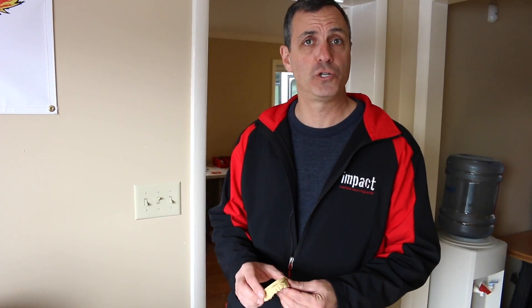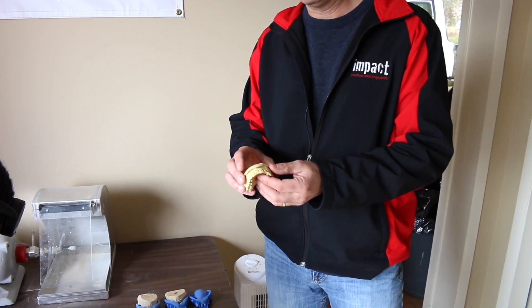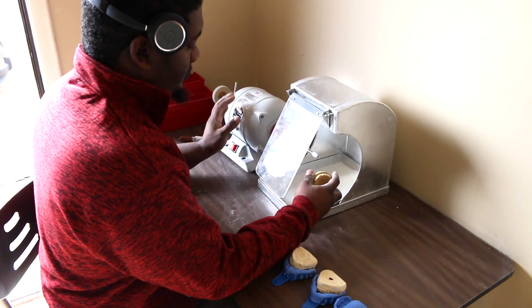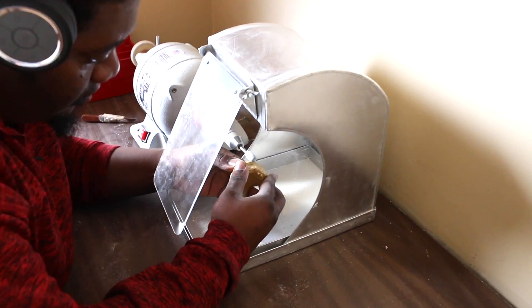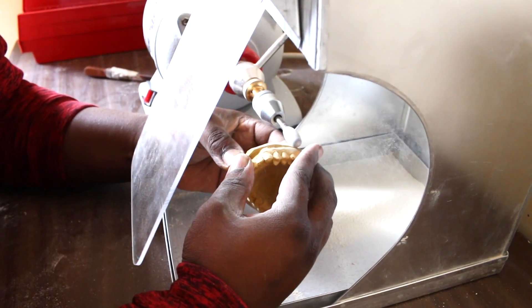What happens with that rough model is that we have to clean it up so that we have a nice neat package to take into the lab to press your guard on. In a few moments, you'll see that we trim down the model of all of the rough edges and make it nice, smooth, and clean. This gives us an exact representation of what's going on in your mouth. The first part of the magic of our mouth guards was receiving your impression, pouring the model, and importantly trimming the model so that it's nice and clean.